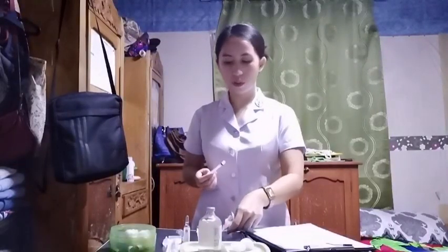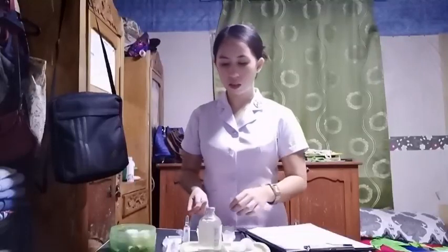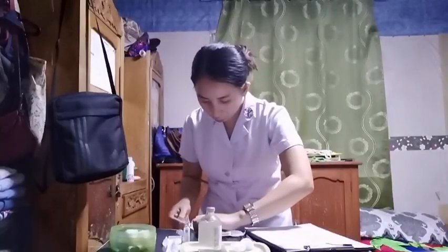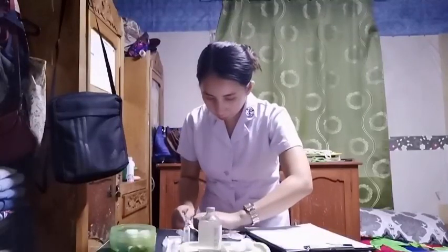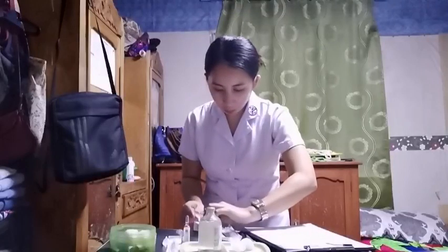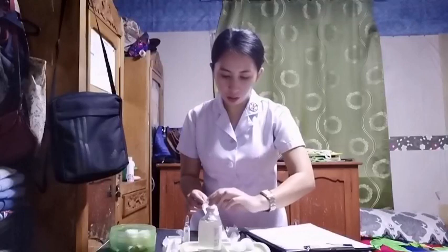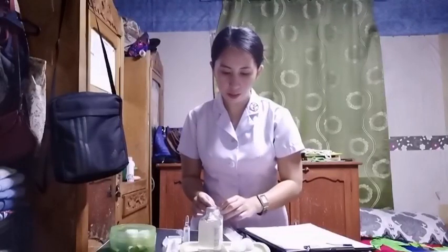Now connect the syringe into the aspirating needle. Be sure that the connection isn't loose to avoid injuries.